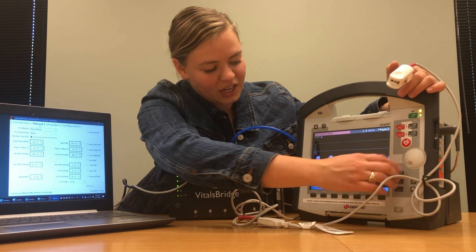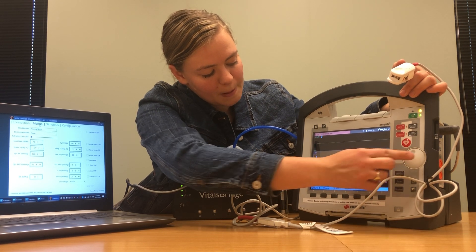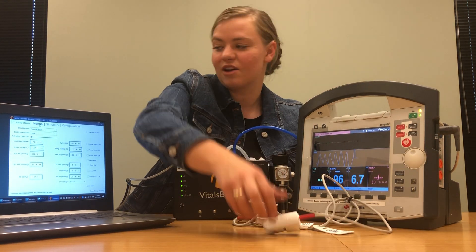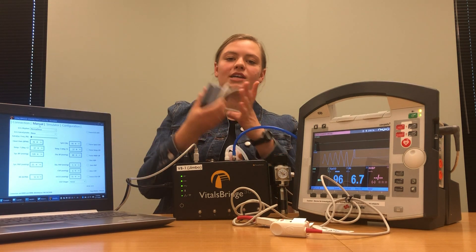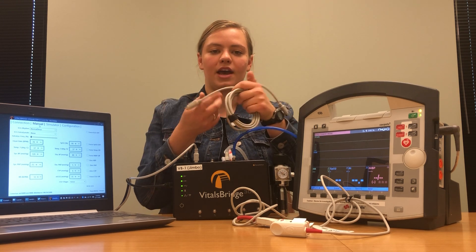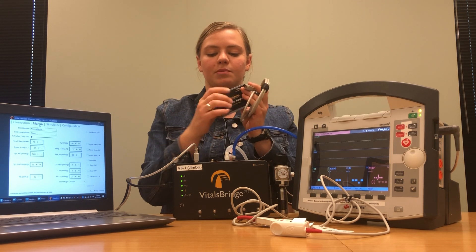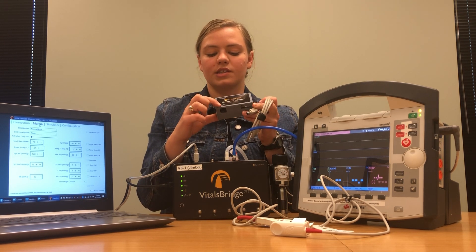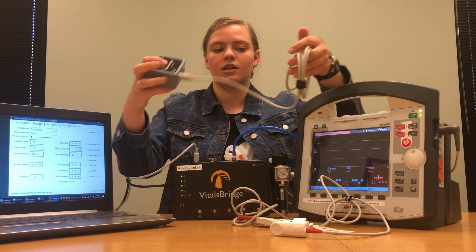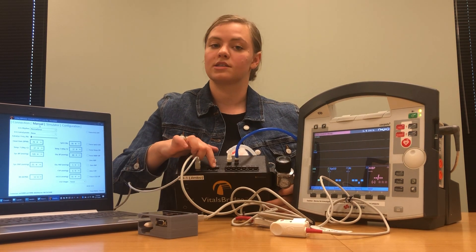If it's working you should see an SPO2 reading in the box, and there we go — we've got our SPO2 reading. You can also change the waveform to show the SPO2 waveform. Now pull out the oximeter adapter that came with your VitalsBridge — it's a small gray box with a cable that has two matching ports on either end. Take one of these ports and plug it into the adapter box where it says SPO2 port VitalsBridge, then take the other end and plug it into the spot on the VitalsBridge where it says SPO2.